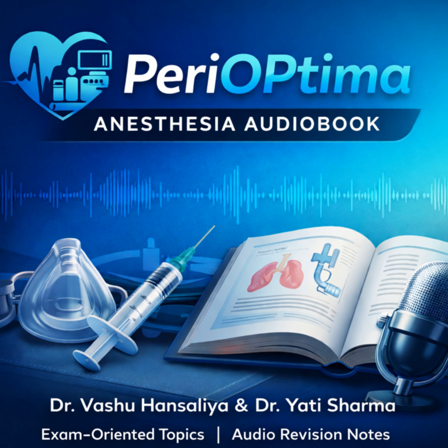IABP is relatively simple. It's usually placed percutaneously at the bedside or in the cath lab. ECMO is a highly complex circuit that requires a trained perfusionist and a dedicated team. It's much higher risk. And then finally, cost and labor. ECMO is orders of magnitude more expensive and labor-intensive than an IABP.